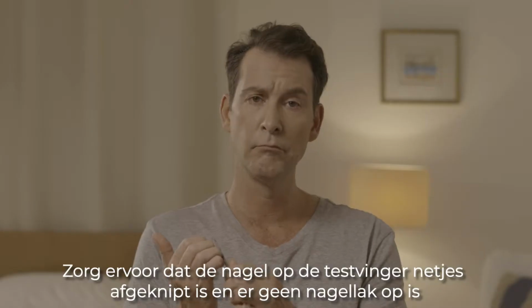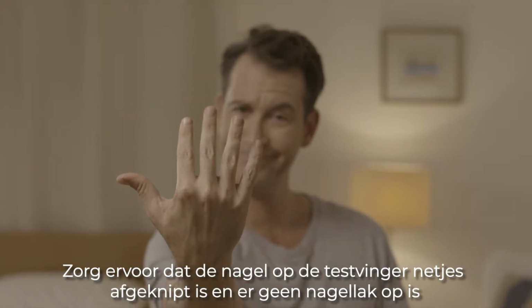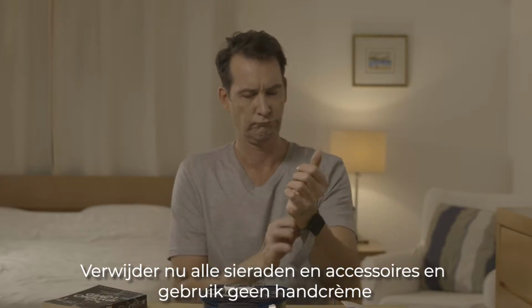Be sure that the nail on your test finger is cut, trimmed, and without nail polish. Now, remove all jewelry, accessories, and avoid hand cream.